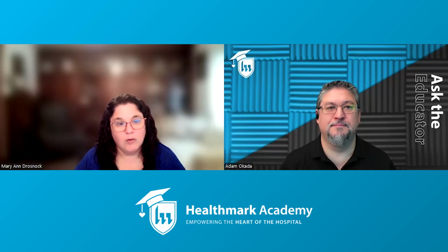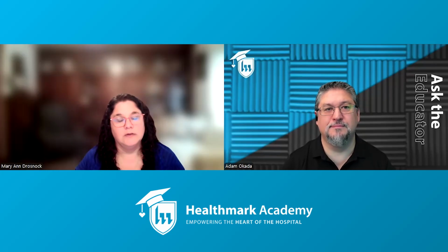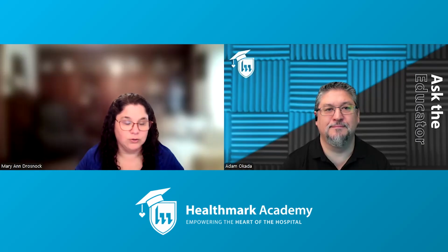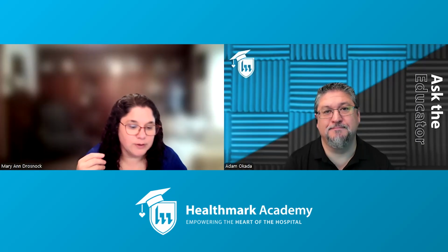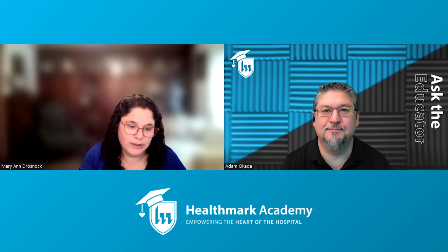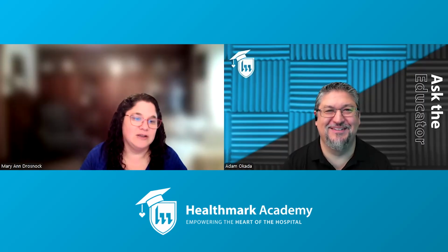Beyond that, we now have recommendations in there to check your leak tester itself. So think about this as confirming that the leak test unit you're using is actually outputting the correct pressure. Because if it's not, you're going to have false results that your leak test is passing when actually that scope could be damaged. So it's a safety risk to our patients, because a lot of these will emit air and you'll hear the psst when you press the lever, the button, like it says to do in the IFU, but your psst might be different and my psst might sound different and you really don't know, right? So it's a very subjective test to know whether that's working or not.